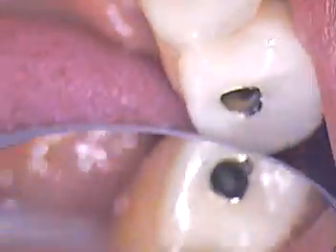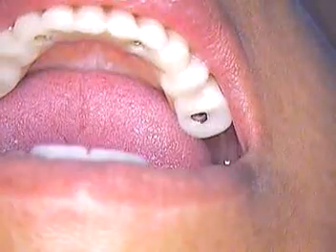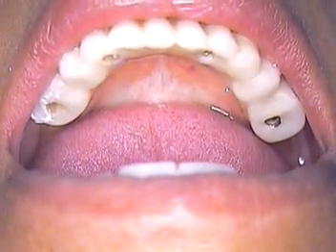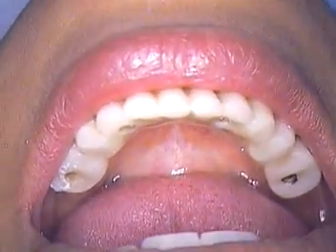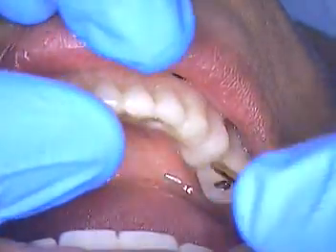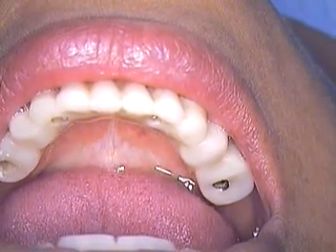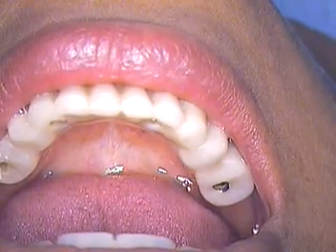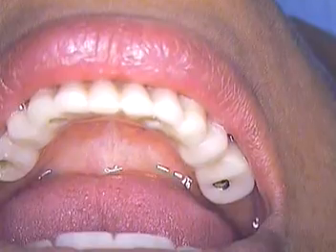Okay, so there are screw access holes all ready to go. Again, all-on-4 case going in with Zirconia as a framework. And we did show you that in the past. Now I'll have you just open up just a hair more. Okay. I'm going to switch to a smaller driver. Okay, let's make life easy.